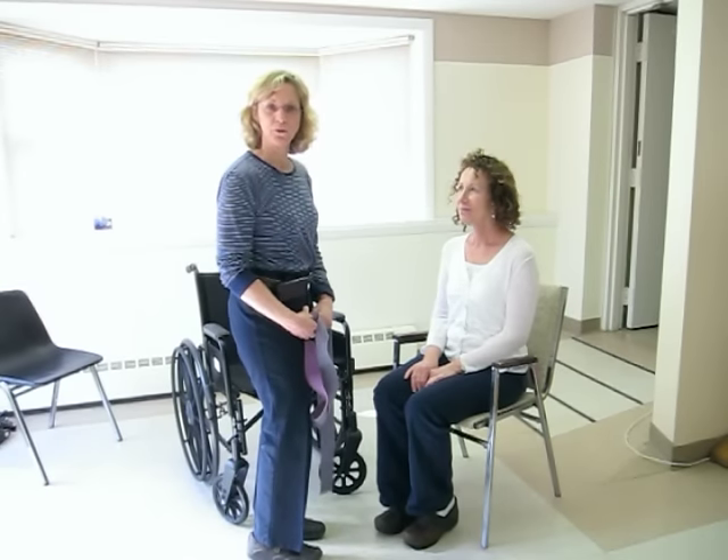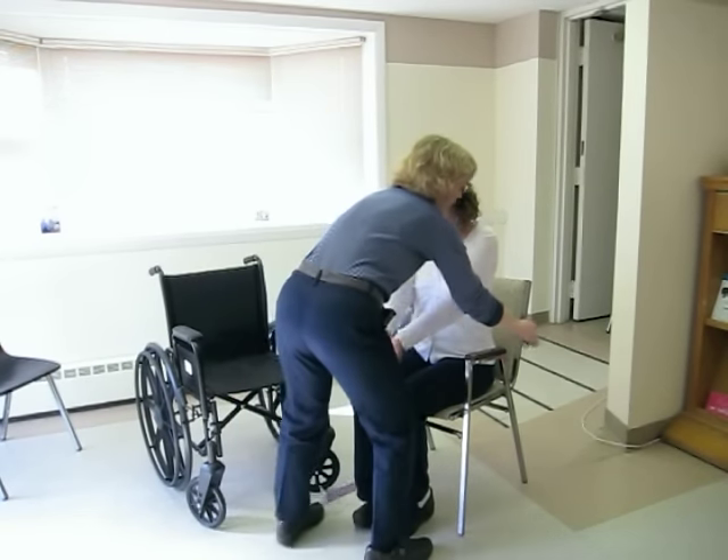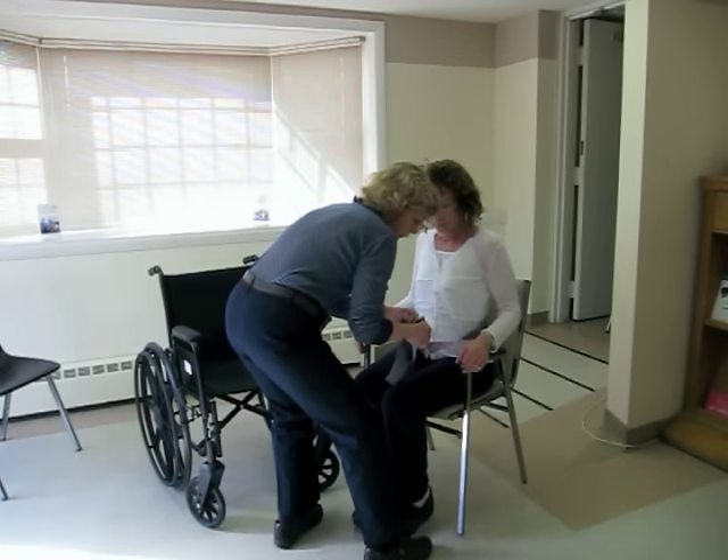Our first transfer is going to be a standard stand pivot transfer where the patient is able to assist. You're going to put on the gait belt first, around the back, through the teeth.